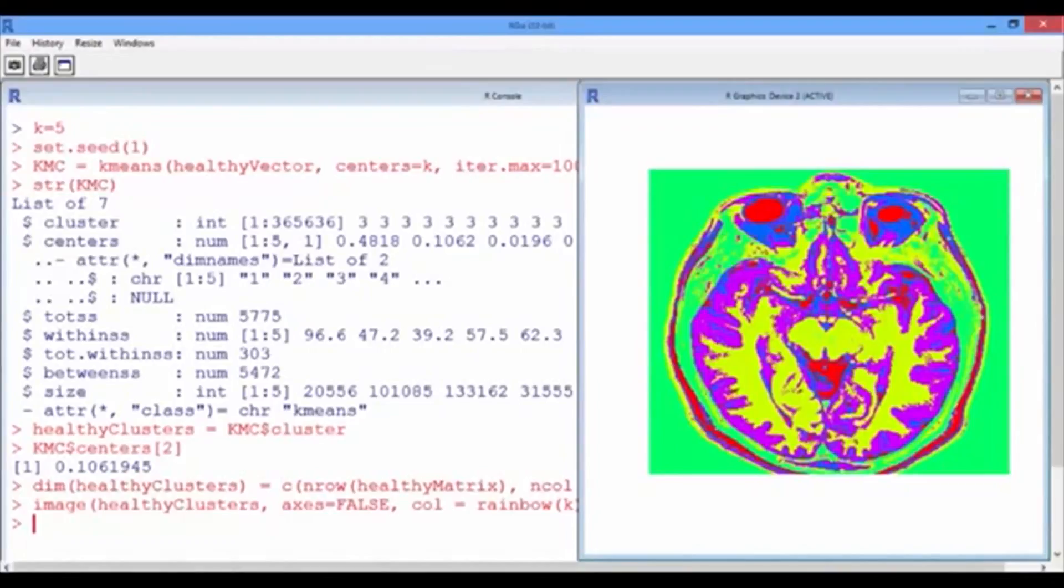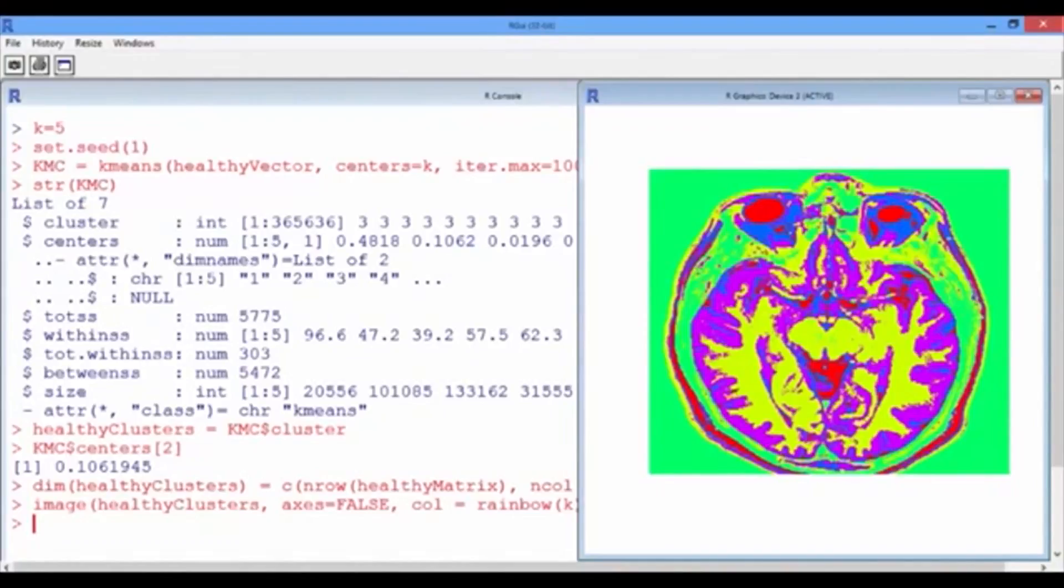In the previous video, we identified clusters or tissue substances in a healthy brain image. It would be really helpful if we can use these clusters to automatically detect tumors in MRI images of sick patients.